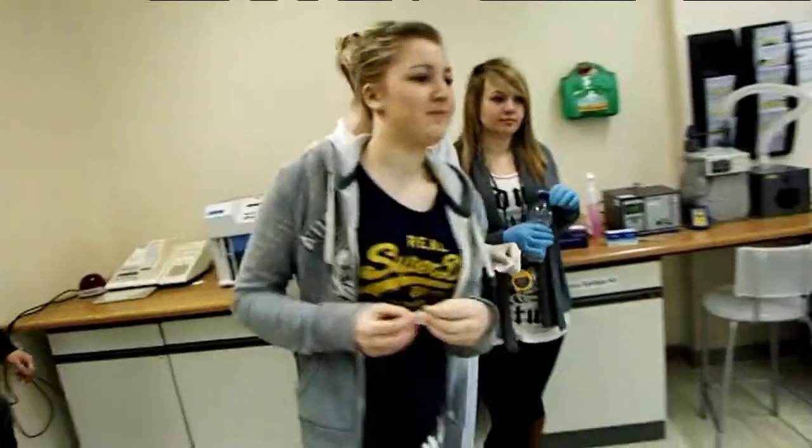We've had to take a blood sample from our participant, which was a resting sample, which we've then analysed on the machines, and she's now consumed 100 grams of dark chocolate, and we're now testing the blood again to see what happens to her blood glucose over the next 60 to 100 minutes.